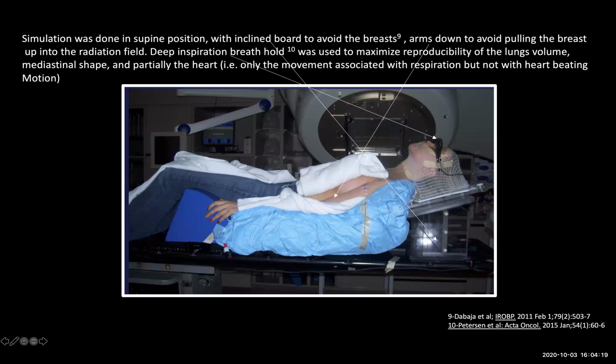You can see the goggles here, which are meant for feedback if you're using an RPM system for the deep inspiration breath hold. These are very important because the patient can then ensure that the breath hold is done on a daily basis in a reproducible fashion. As opposed to when we're gating to chase a tumor, in lymphoma the idea is to expand the lung on a daily basis to the same volume, because that will mean that the heart is moved to the same position and the mediastinum is thinned to the same level.